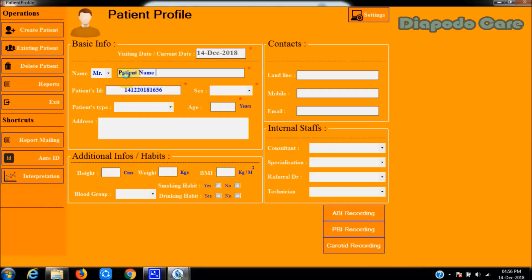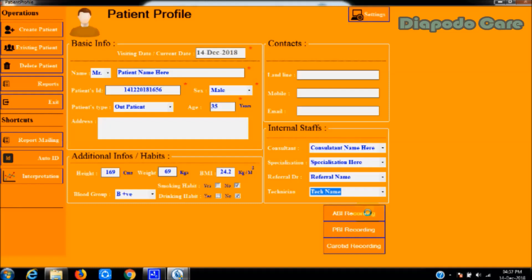Enter patient profile details including name with salutation, patient ID, gender, patient type, age, and other fields. Fields marked with a red star are mandatory; others are optional. Body mass index will be automatically calculated after entering patient height in centimeters and weight in kilograms. After completing patient details, select the ABI recording button for ankle brachial index screening, the PBI recording button for penile brachial index screening, or the carotid screening button. Ensure the Vassabi hardware main unit is turned on and ready before proceeding.